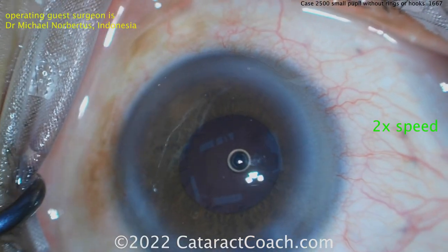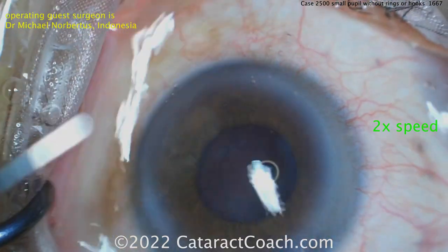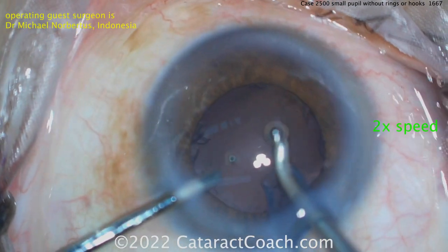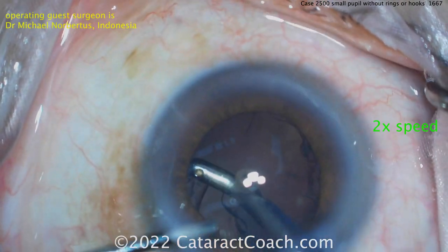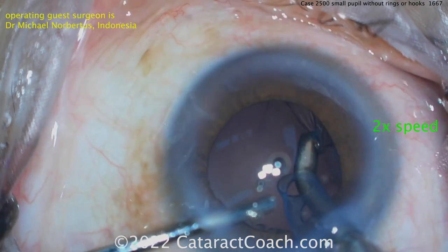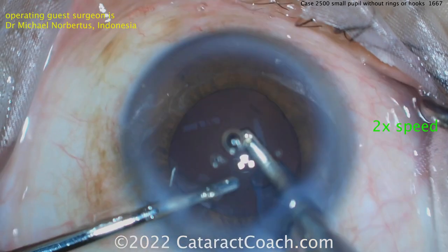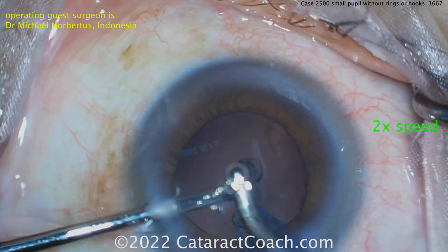We showed it two times normal speed but it's still a fantastic case and very efficient. If this is your 2500 case I would love to see your 20,000 case. With high infusion pressure you got the pupil to expand a little bit more, which is nice. Cortex removal here - that nice expansion of the pupil with the higher infusion pressure really gives you a much better view to remove all this. That's cleaned up very nicely.